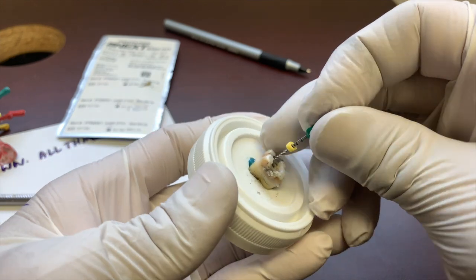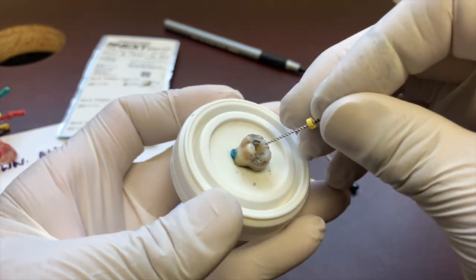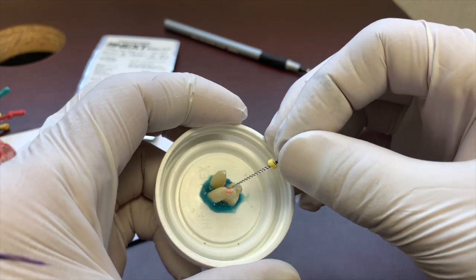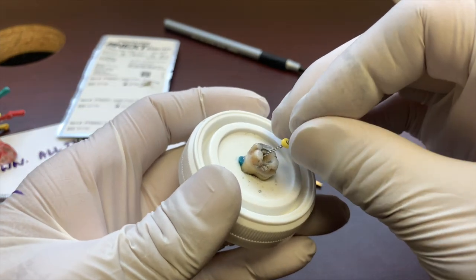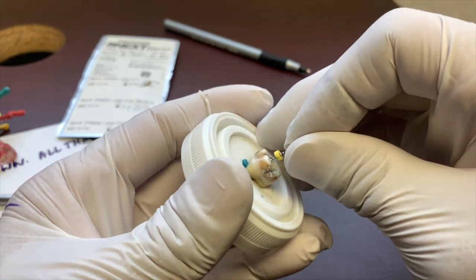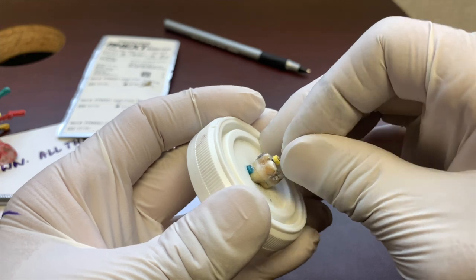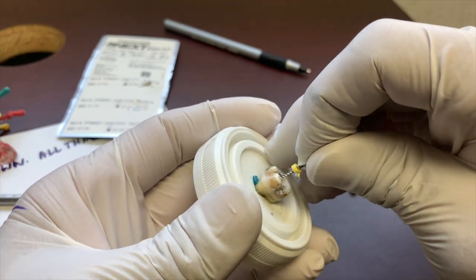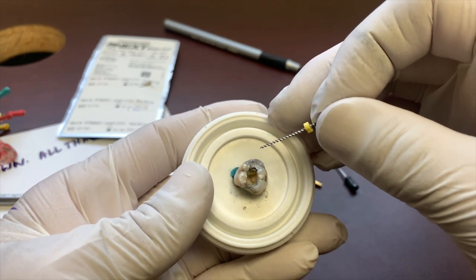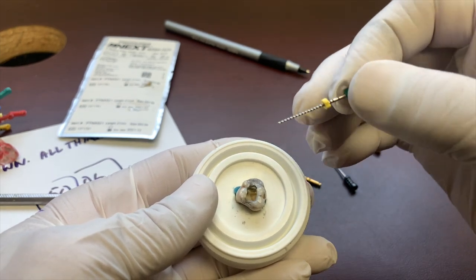What I'm trying to do is debride the biofilm on the entire portion of that canal. Now, you just have to be careful around the inner aspect of those roots, because sometimes these are really aggressive, so you can strip perforate. You don't want to do that. What we're doing is just a light filing. It does not need to be really hard. We're just trying to get rid of that debris, biofilm, even vital tissue if it's vital, and debride that. And remember, a significant part of what we're trying to do is create the chemomechanical room for irrigants to get down there and disrupt the biofilm.